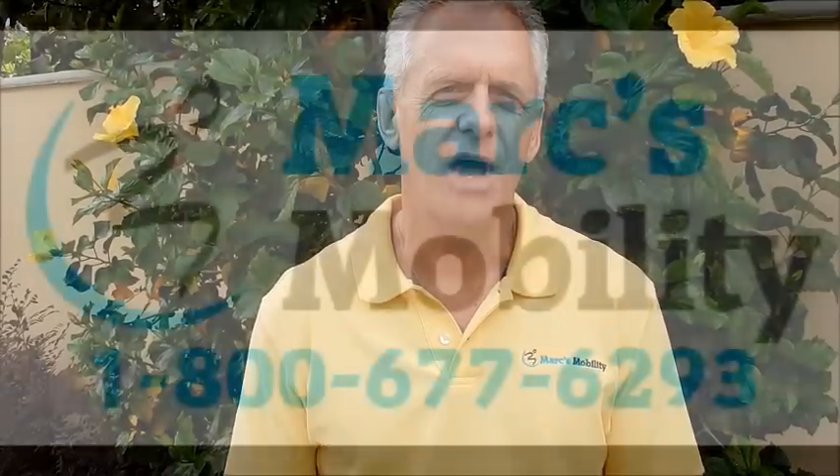Hi, my name is Mark. I'm the owner of Mark's Mobility. I'm here today to explain to you about this chair. If you need to reach us, you can reach us at marksmobility.com or call us at 800-677-6293.